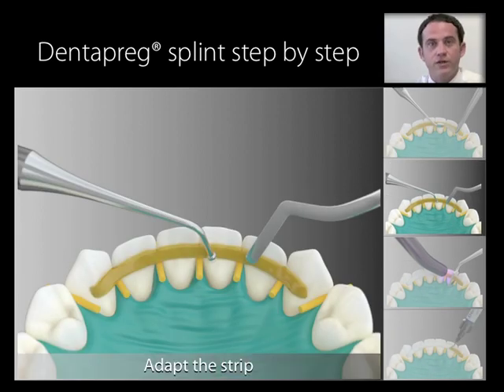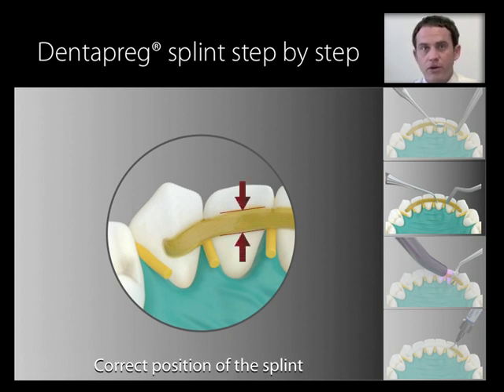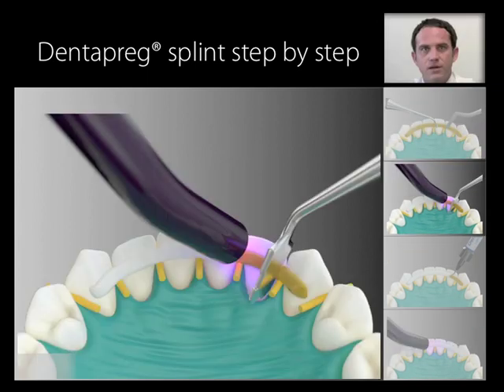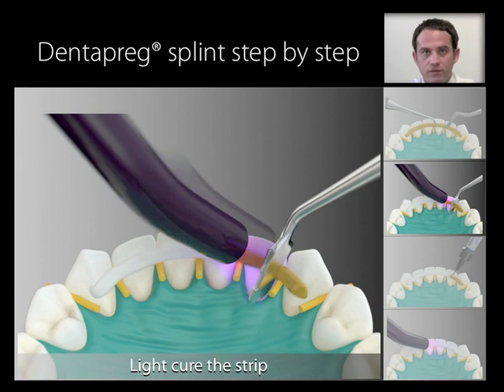Adapt the strip to the tooth surface — correct position is important. The strip should be placed in the middle third of the height of the crown, and two-thirds of the width of the crown on the abutment teeth, and it should follow the points of contact. When the strip is adapted to the correct position, light cure for 40 seconds per tooth, going tooth by tooth from one end of the splint to the other.